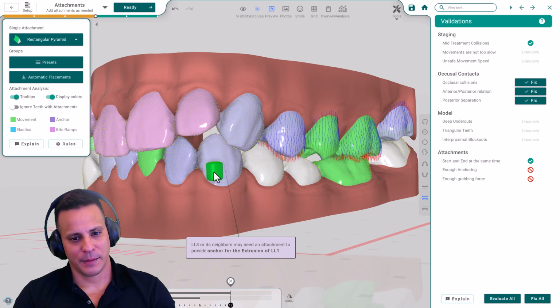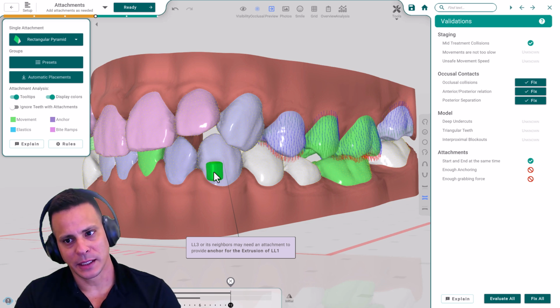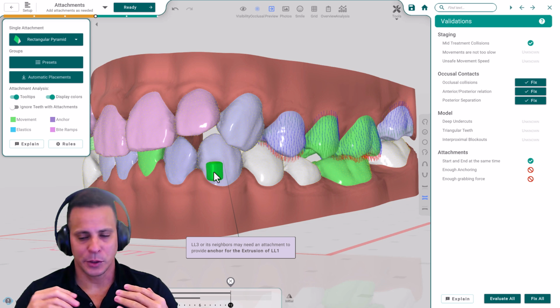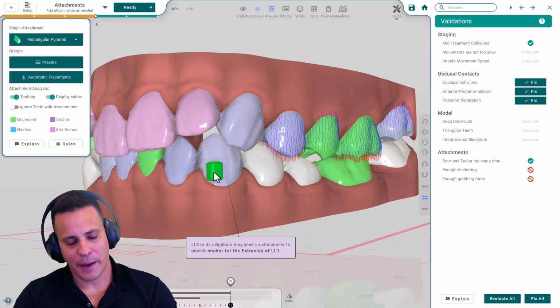I hope you like this. We are really excited, and this is just a first preview. We will need to tweak these numbers. There are going to be more rules, and I'm excited to see how you will like it.